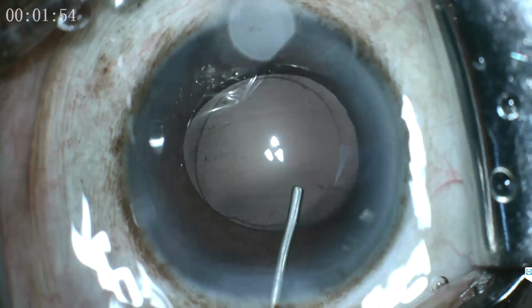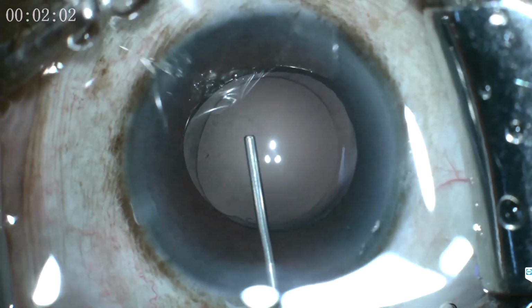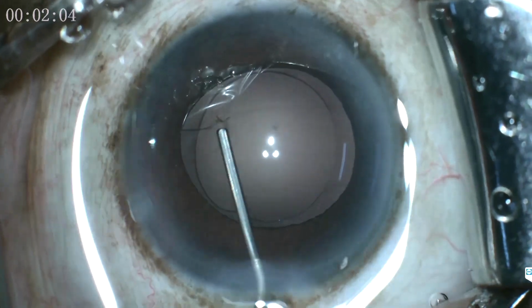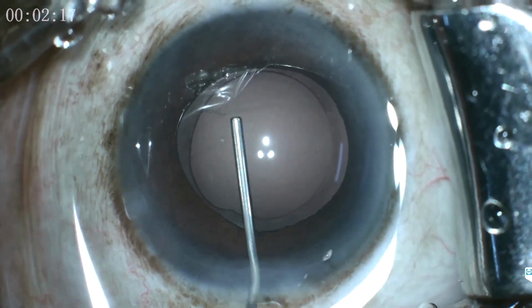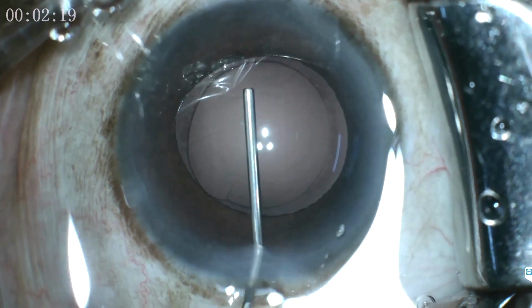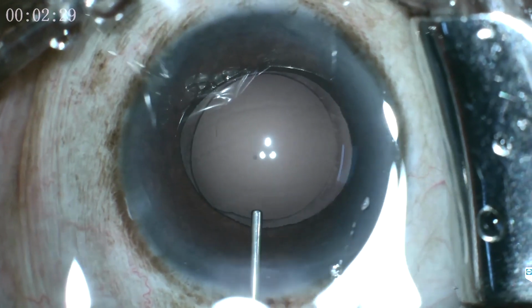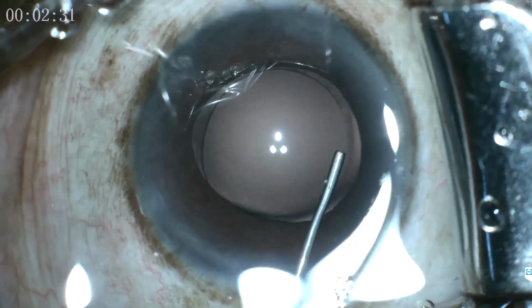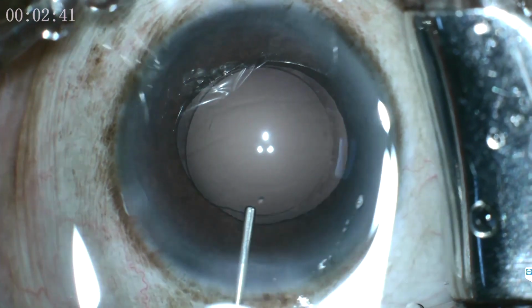Cortex aspiration doesn't end with the cortex aspiration alone. Posterior capsule polishing is very important. With bimanual, it is very easy. In a coaxial system, you have to use irrigation with a cannula and polish the posterior capsule. At least 5.5 mm of capsule should be as clear as possible, like cellophane paper, before you put in an intraocular lens. I do it in each and every case. My PCRs are highest with capsule polishing among all the different stages.